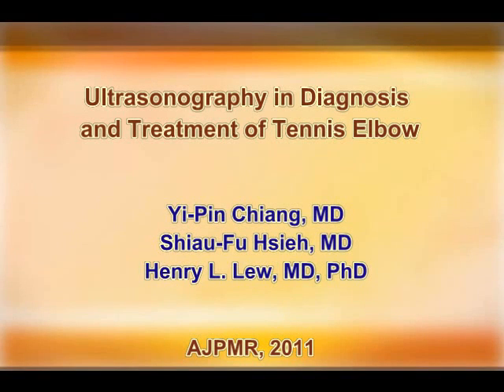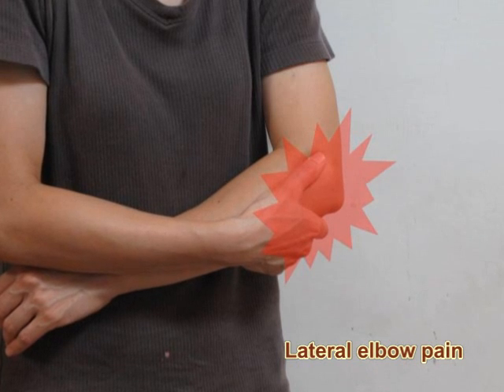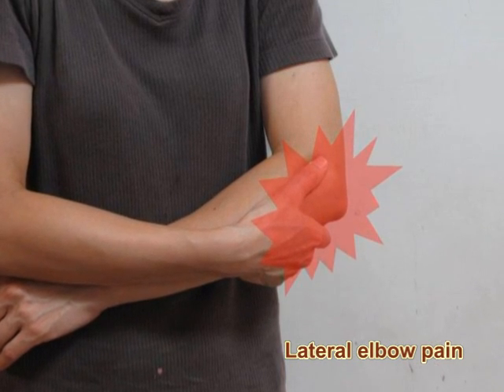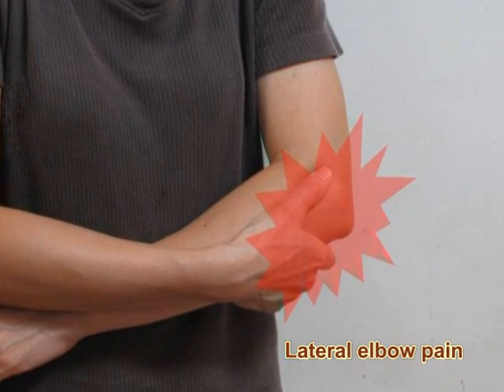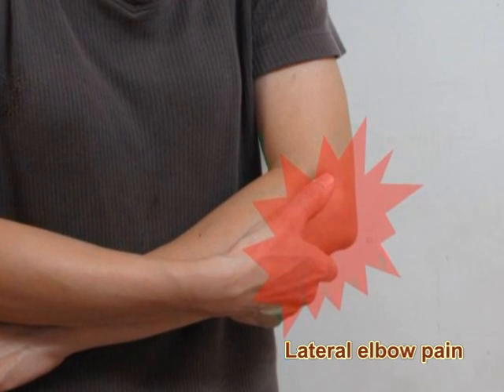Ultrasonography in diagnosis and treatment of tennis elbow. Tennis elbow is a common pain syndrome in the PM&R clinics. It is often referred to as lateral epicondylitis because of lateral elbow pain.